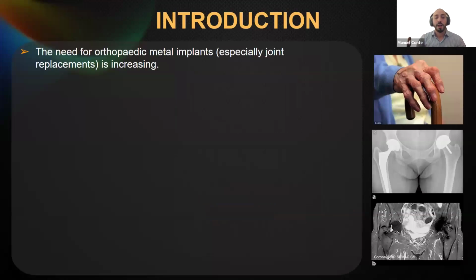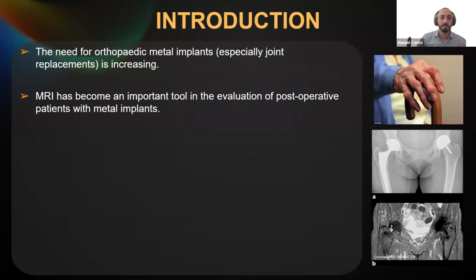So we are getting old. I mean, the population is getting old, so the need for orthopedic metal implants is increasing, especially joint replacement. So I'm sure that even you, scanning every day, get more and more patients with metal implants.